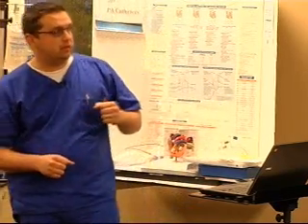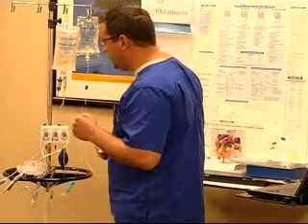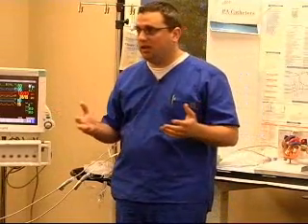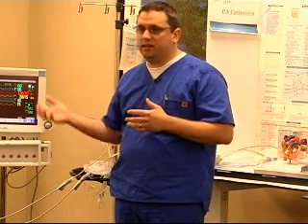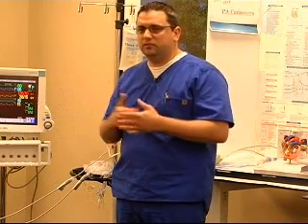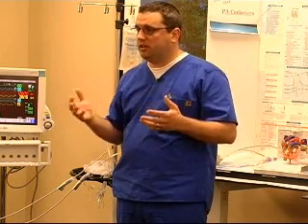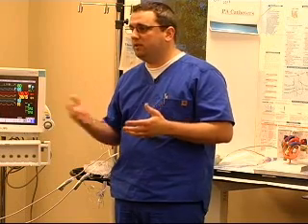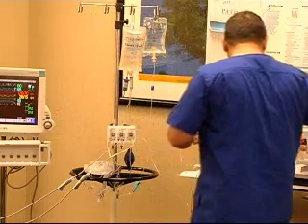All right, so let's talk about mixed venous sampling, okay? How do we confirm, because we may get a cardiac output and index that looks okay, or maybe doesn't look like our patient looks. So we get a cardiac index of 2.5, and we look at the patient and they haven't made urine and they look kind of blue and they're cold, and we think that can't be right. So how do we confirm that? This is one way you could confirm it, okay? You can do a mixed venous sample.